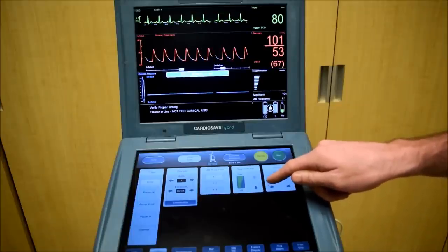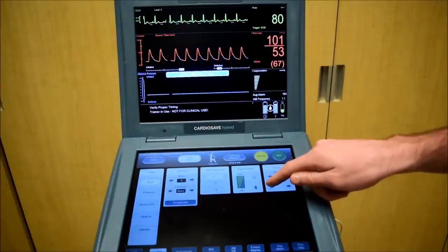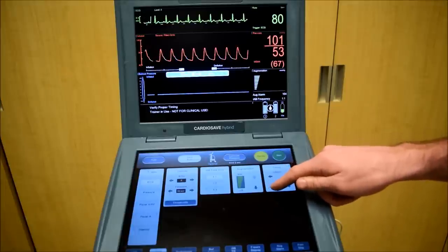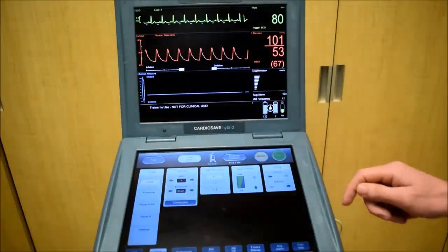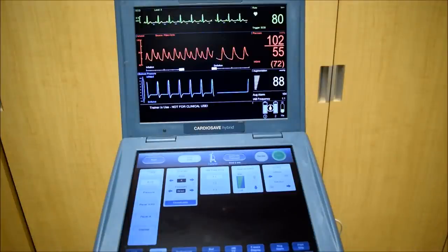Another way of remembering this is 'fiddle to the middle.' This phrase refers to these traces moving to the middle. Now I'll restart the balloon with the latest inflation and earliest deflation. Again, this is the safest place for the patient to be, but not the most efficient.